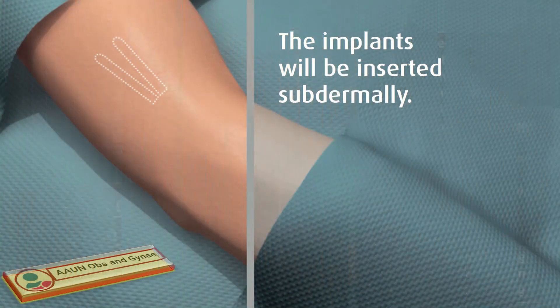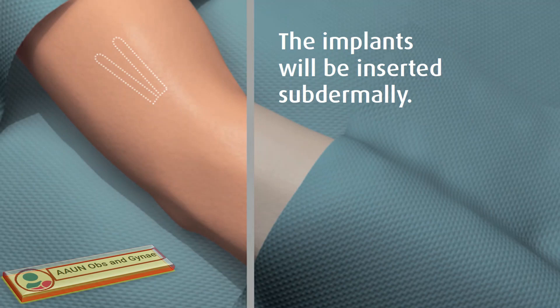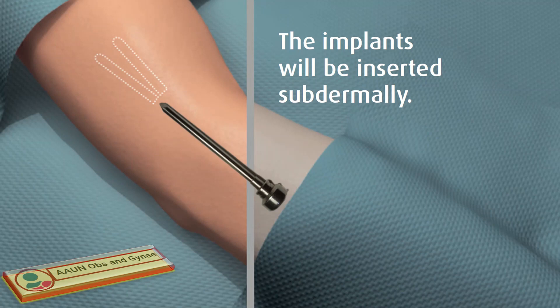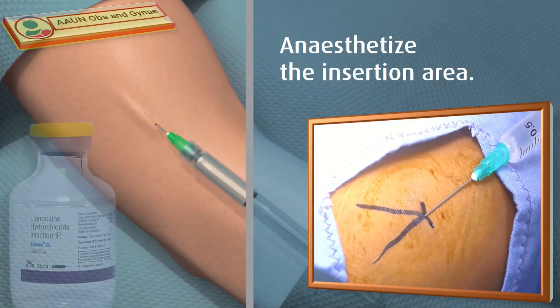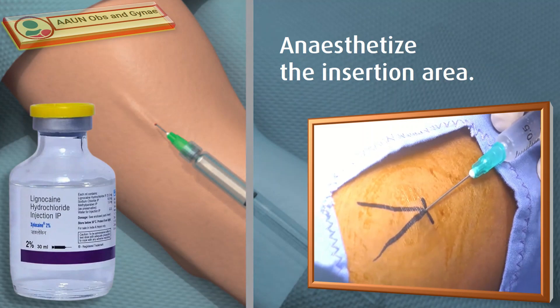Ask the patient to lie down on the examination table with her non-dominant arm extended on sterile cloths on the other table at a right angle to her body. The implant will be inserted subdermally through a small incision using a disposable trocar in the shape of a narrow V opening towards the armpit. First, determine the absence of known allergies to the anesthetic agent or related drugs.